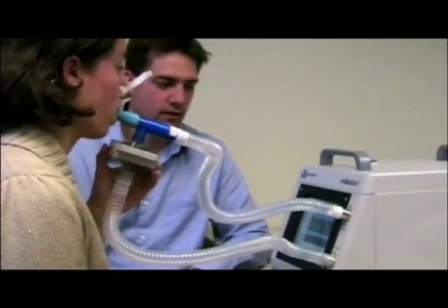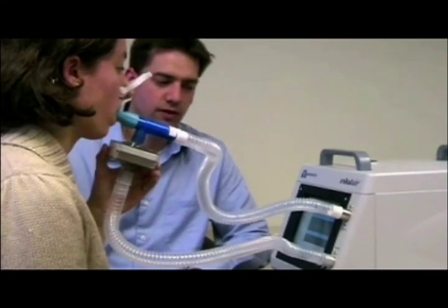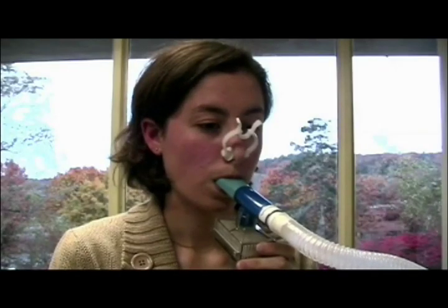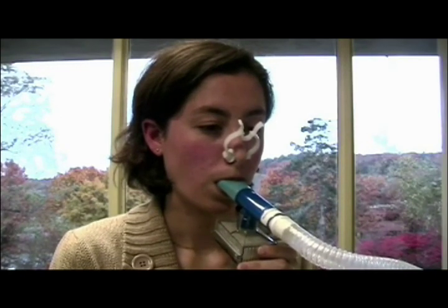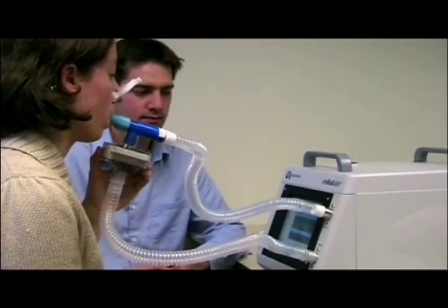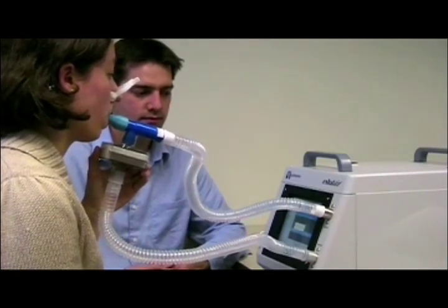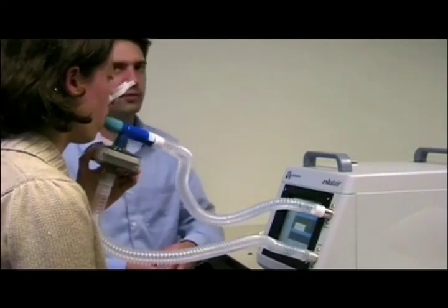Finally, a few study participants — only fifteen in total — who have volunteered in advance, will be asked to breathe normally into the machine, that is, tidal breathing, for an additional thirty minutes. This test also involves breathing onto a filter that will capture the content of the exhaled particles. This small group will allow study analysts to confirm that the ten deep breath pattern provides the same particle content information as the longer tidal breathing pattern.